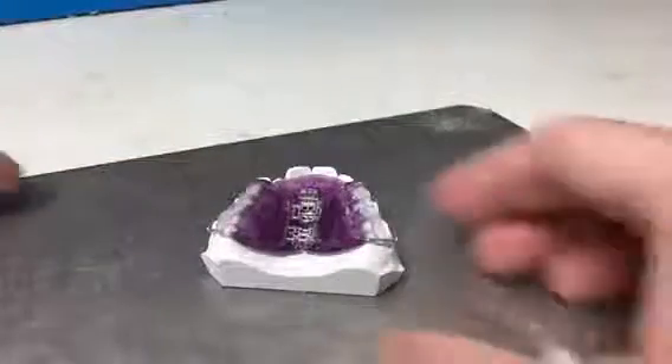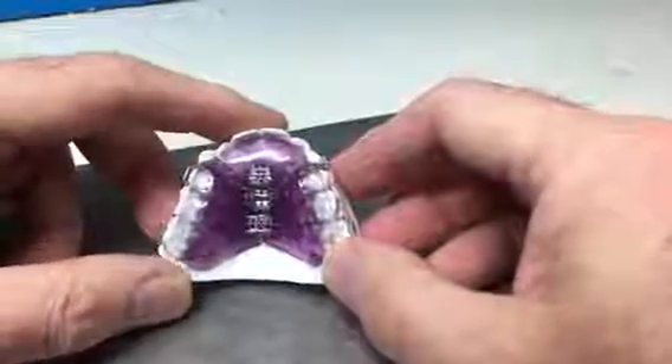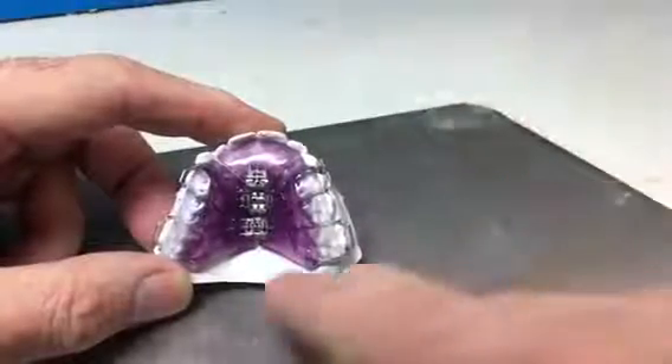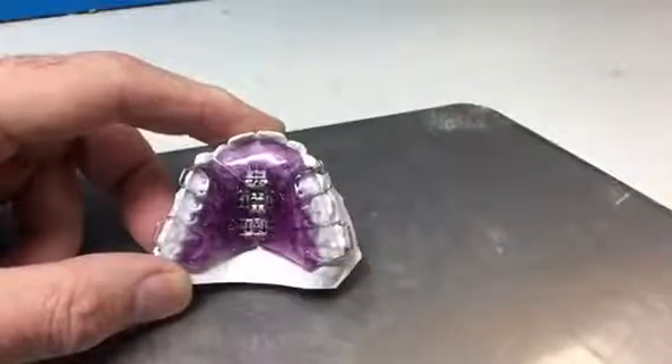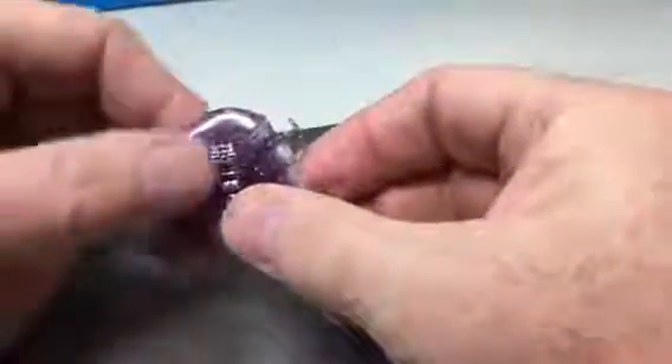This appliance is called a 3D Schwartz and if you look at this carefully you'll see the three screw mechanisms in it. There's one at the front that will move the anteriors forward and the two center screws behind that. Again, just moving these screws in the direction of the arrows.